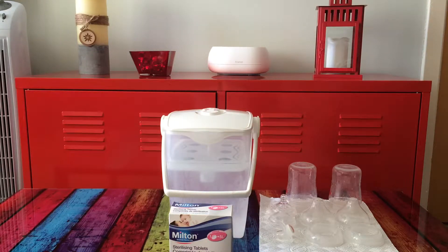Hello, today I would like to review the Milton Cold Water Sterilizer.